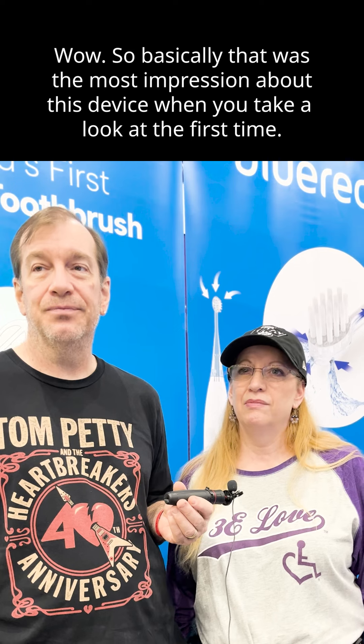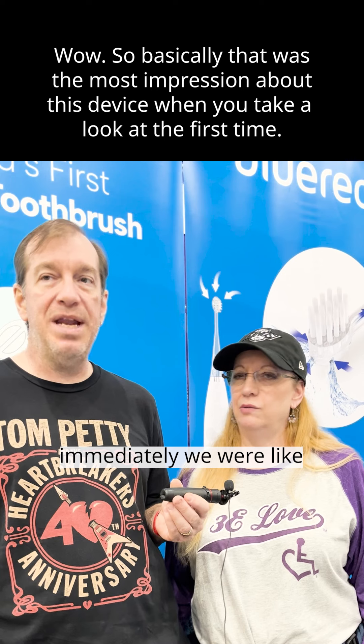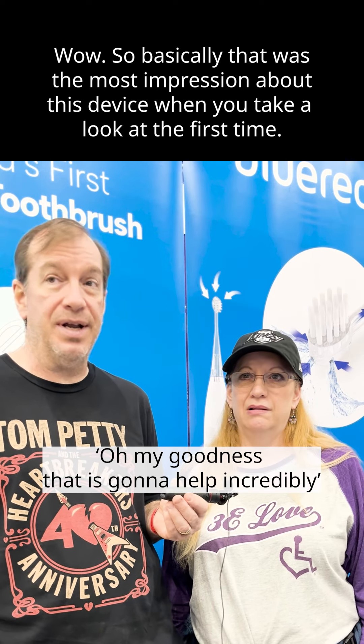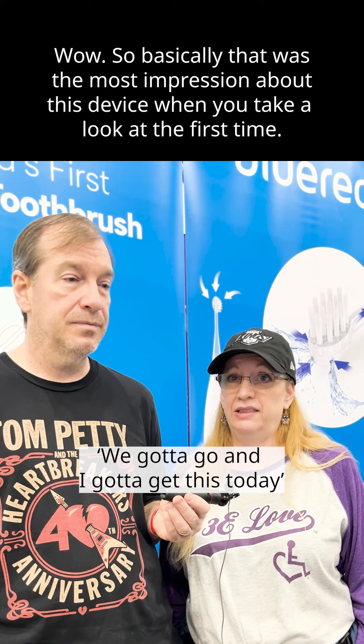Wow. So basically, that was the most impressive thing about this device when you first saw it? Absolutely. Right away, immediately, we were like, oh my goodness, that's going to help. I saw this and I said we got to go and I've got to get this today.